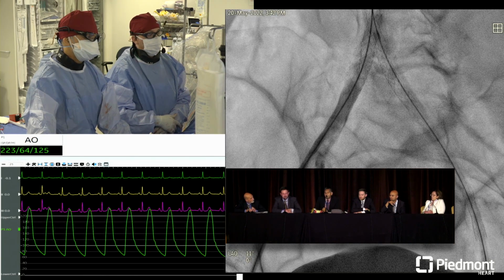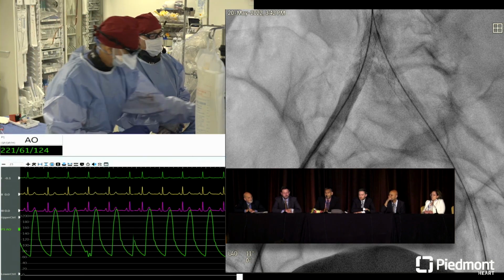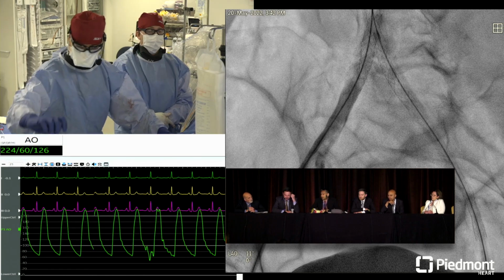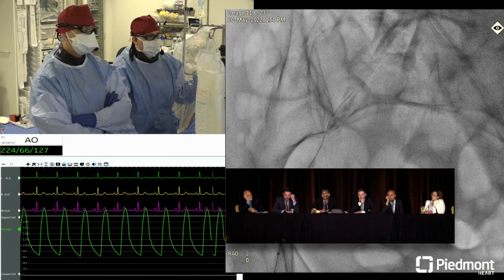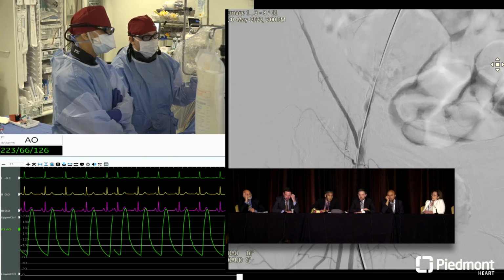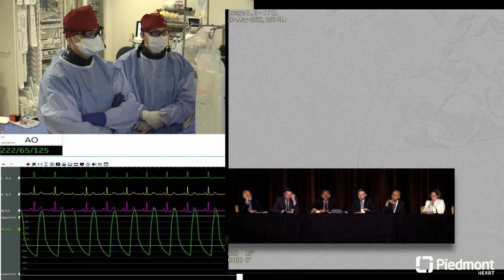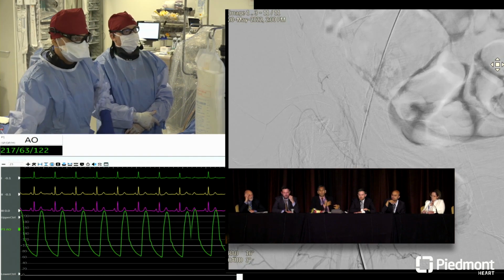Yeah, it looks like you're going to have to cross the lumen based on the initial pictures that were shown about how complicated the access was. It's crazy. You have to use a dilator over a micropuncture wire just to get started. Yeah, I think the entire external has to be treated on that side. Yeah, you're right, Bo. The entire external definitely needs to be treated, and just to show everybody where we're at there, based on our initial pictures, it was going to be difficult not to. You can see how far down practically into the CFA. I think we got a spot right there by that lateral circumflex iliac to land that stent. Yeah, that's at least where I'm going.